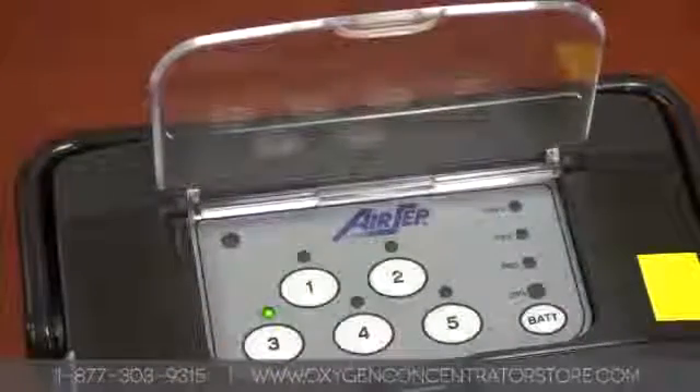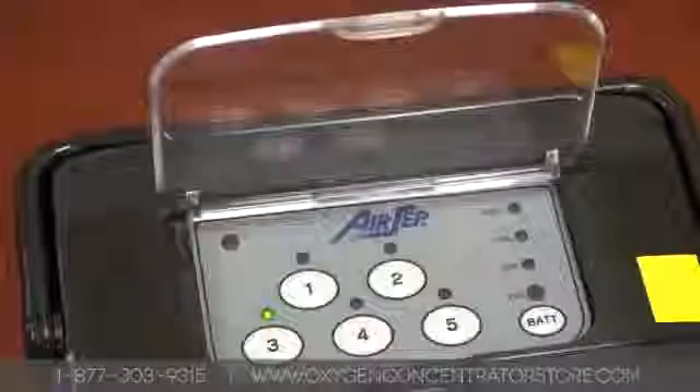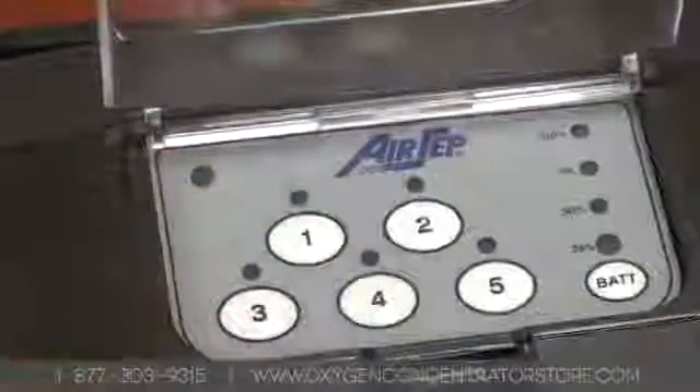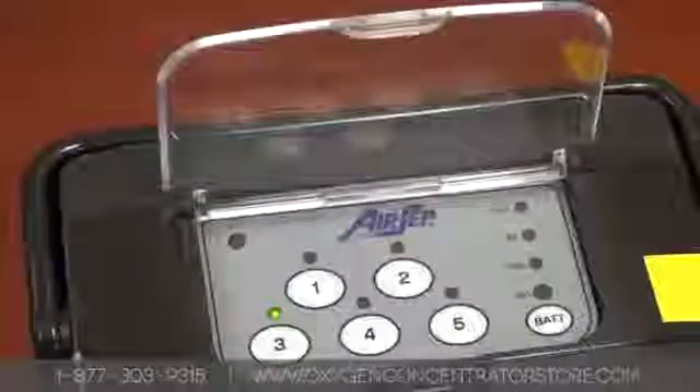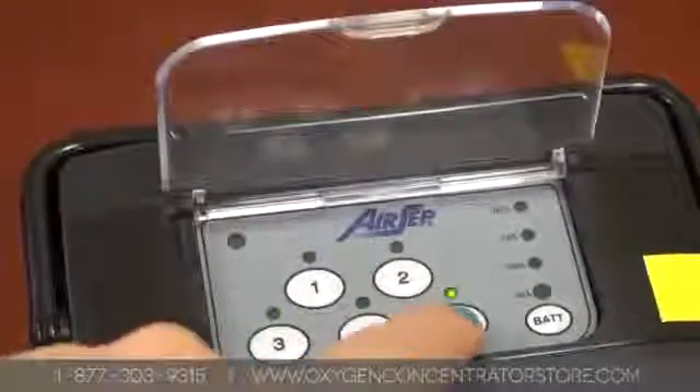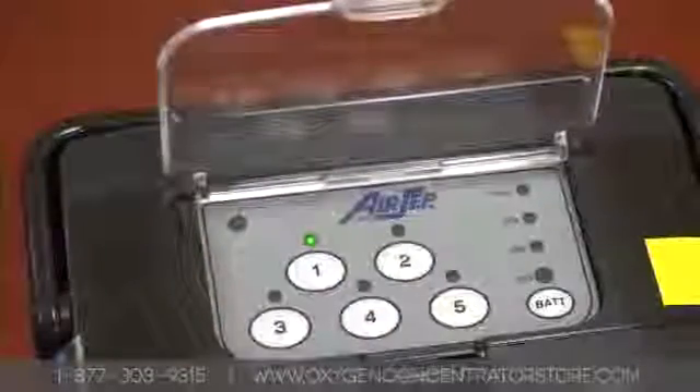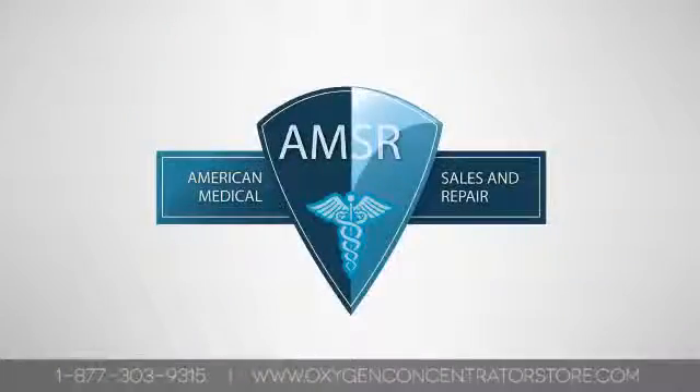Turning on and off. Make sure your concentrator is fully charged. Lift the protective covering over the command panel and press the number you desire for your setting. The machine will turn on and operate at this setting. To turn the machine off, press the number again.